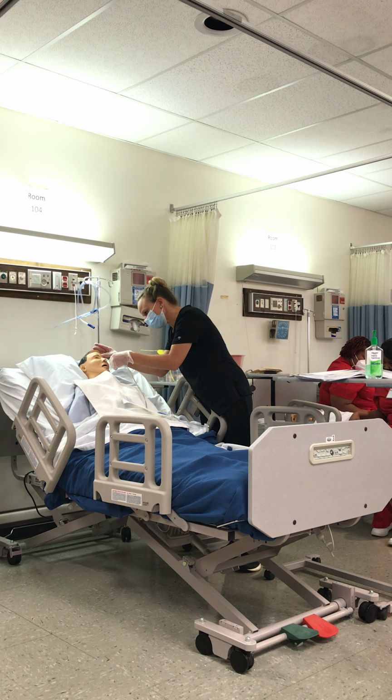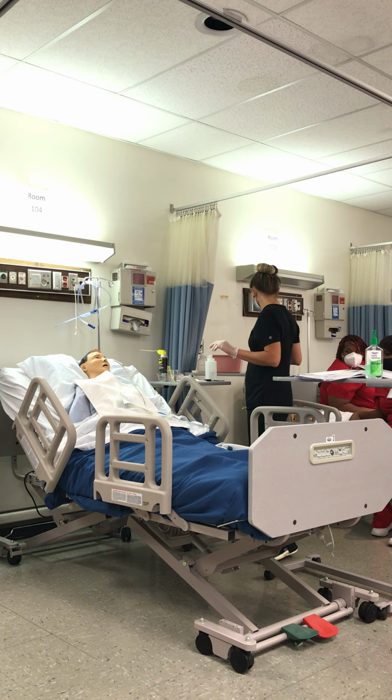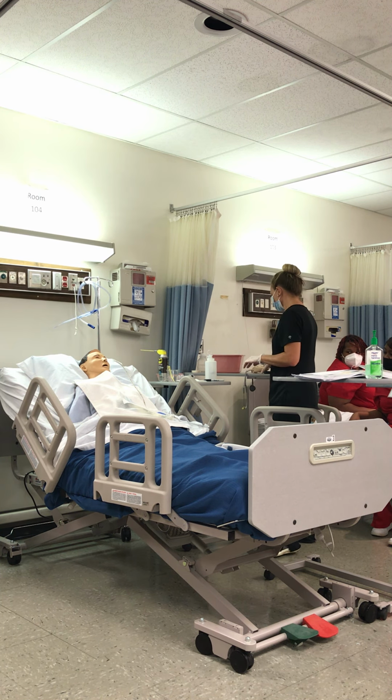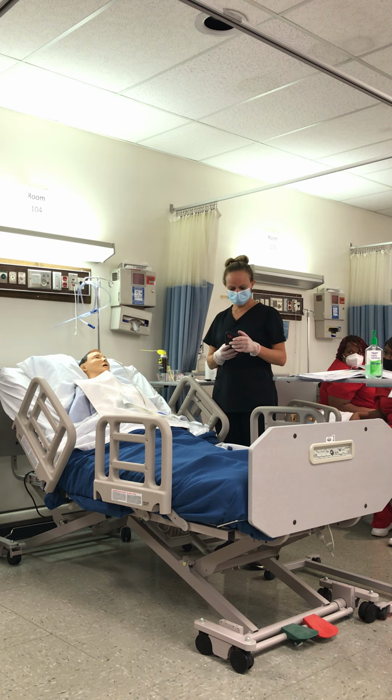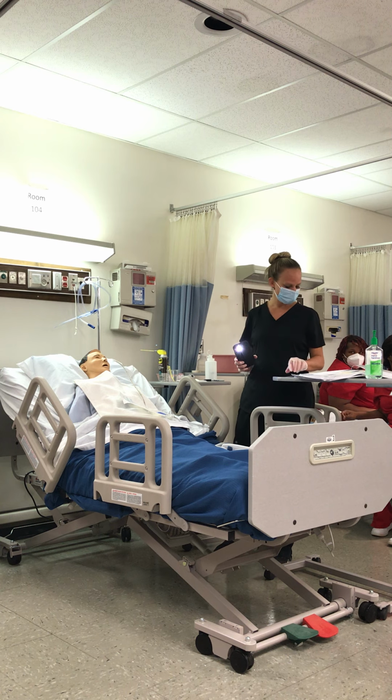So we're going to pass it to where? To the first mark. First mark, okay? Now what do I want to do? You want to look in the back of the throat, and get some water so they can sip it as you go. Use the flashlight. There you go.